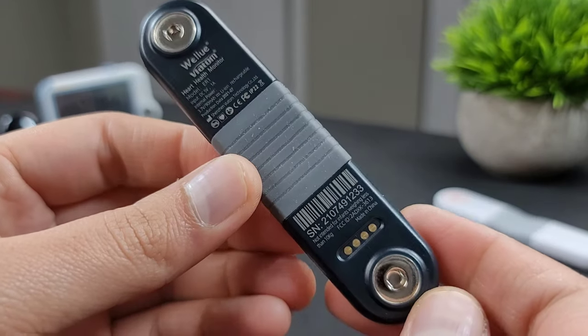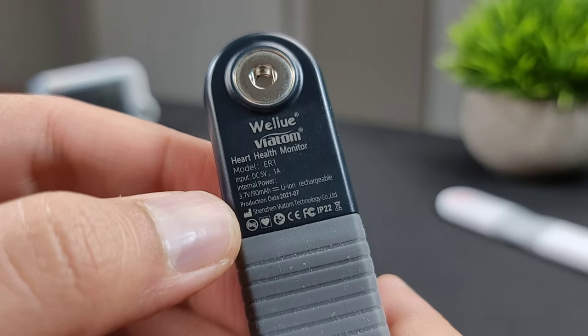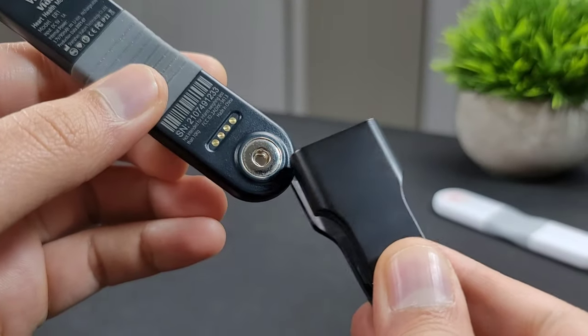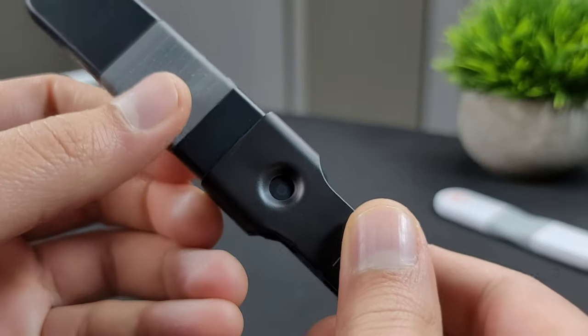This is an all-day ECG/EKG recorder by Wellue which uses artificial intelligence to detect and record cardiac abnormalities which are hard to detect during a routine checkup.